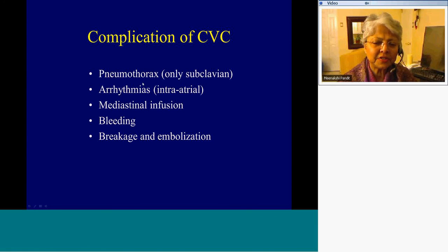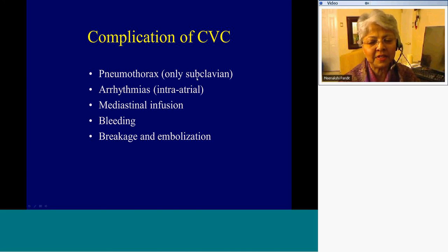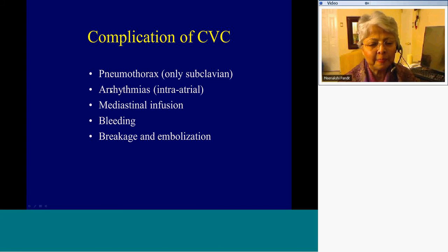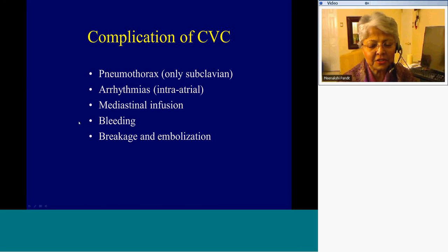The complication unique to central venous lines is pneumothorax — only with subclavian approach. So if you encounter subclavian venous line placement, always look very closely for pneumothoraces. Other complications include arrhythmias if extending into the atrium, mediastinal infusions, bleeding, fracture of catheter, and embolization distally into the lung.